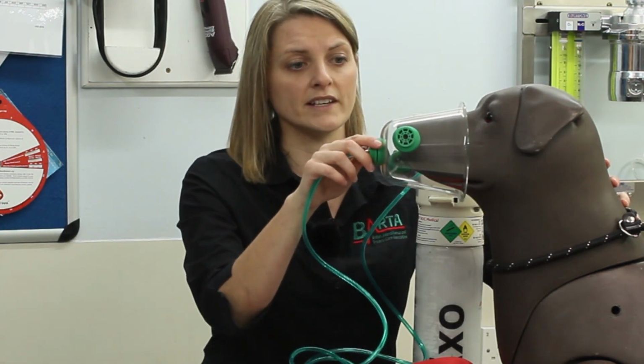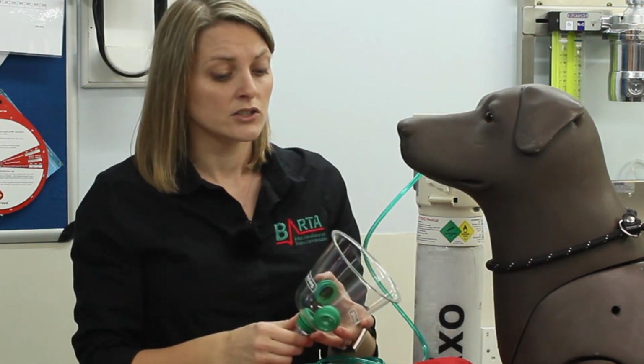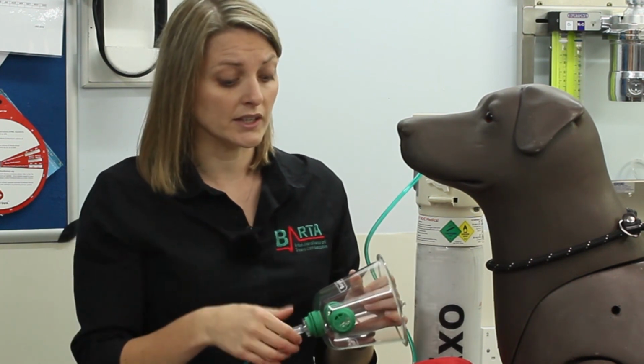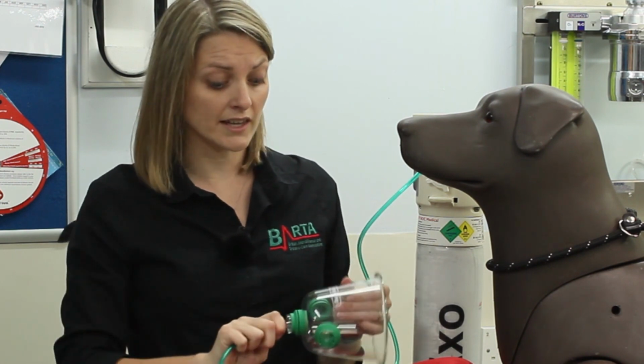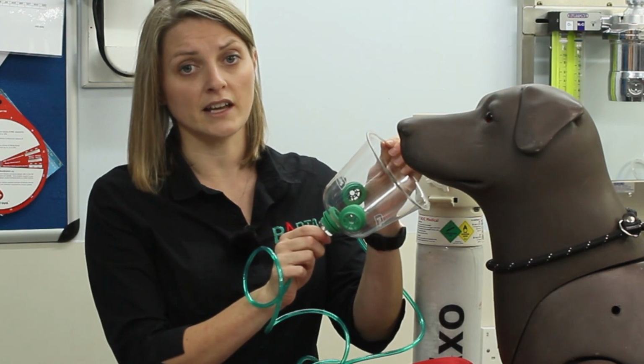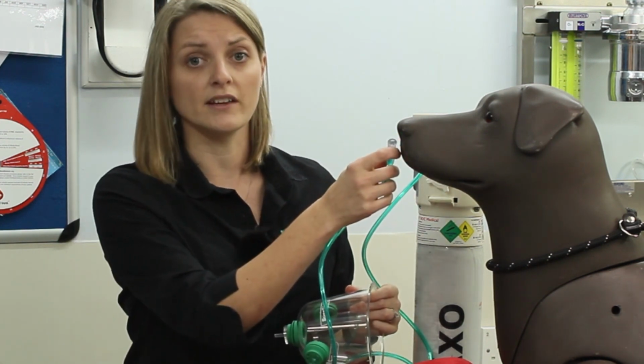If they're really not tolerating this, then you can consider either moving the animal to an oxygen-enriched environment, such as a cage, which you then cover in a towel or plastic, and then put the oxygen inside that. Or you could consider just a flow-by, so holding the mask near the animal's face, or removing the tube and just placing that near the animal if they find that more tolerable.